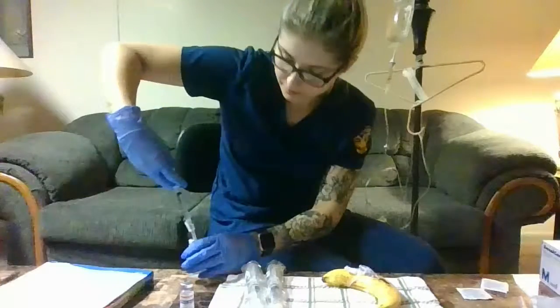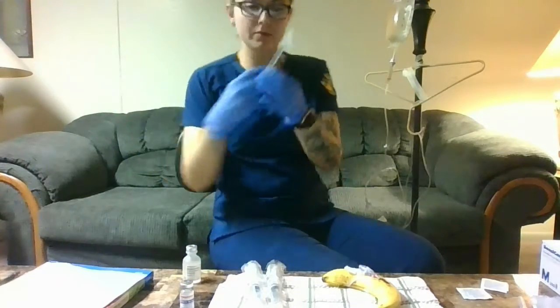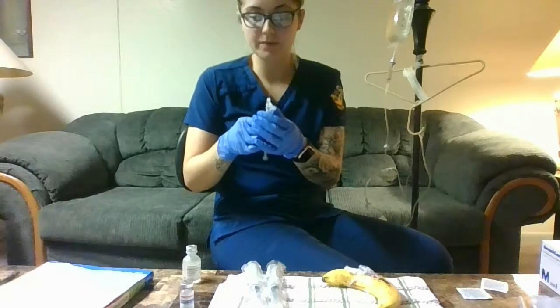Okay. Just a double check. 3 milliliters.